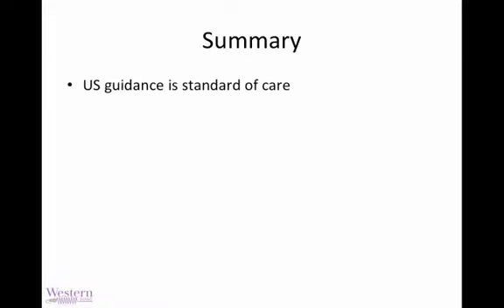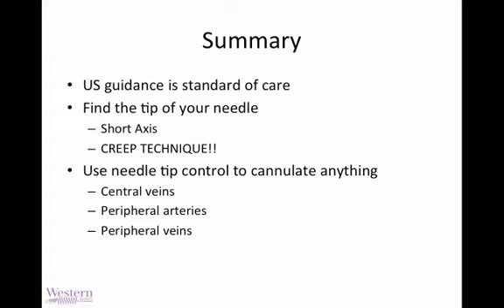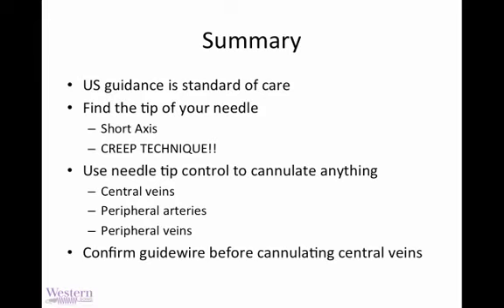So in summary, you're going to use ultrasound guidance from now on. We're sure of this. You're going to use the short axis, I hope, and the creep technique in all its glory. It's a fabulous technique. Needle tip control from that technique will allow you to cannulate veins, arteries, peripheral veins, even entertain regional anesthesia techniques and tapping of joints. As long as you master tip visualization, you can become an excellent needle wielding physician or provider. And I strongly emphasize confirming your guide wire before cannulating anything, and beware of your overconfidence and the overconfidence of others.